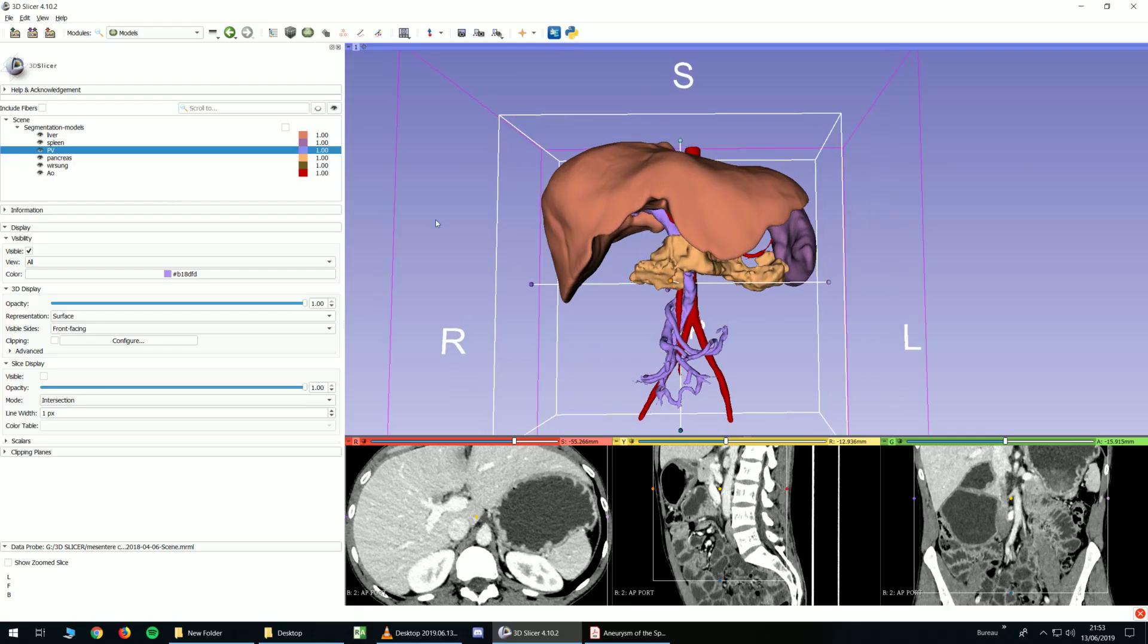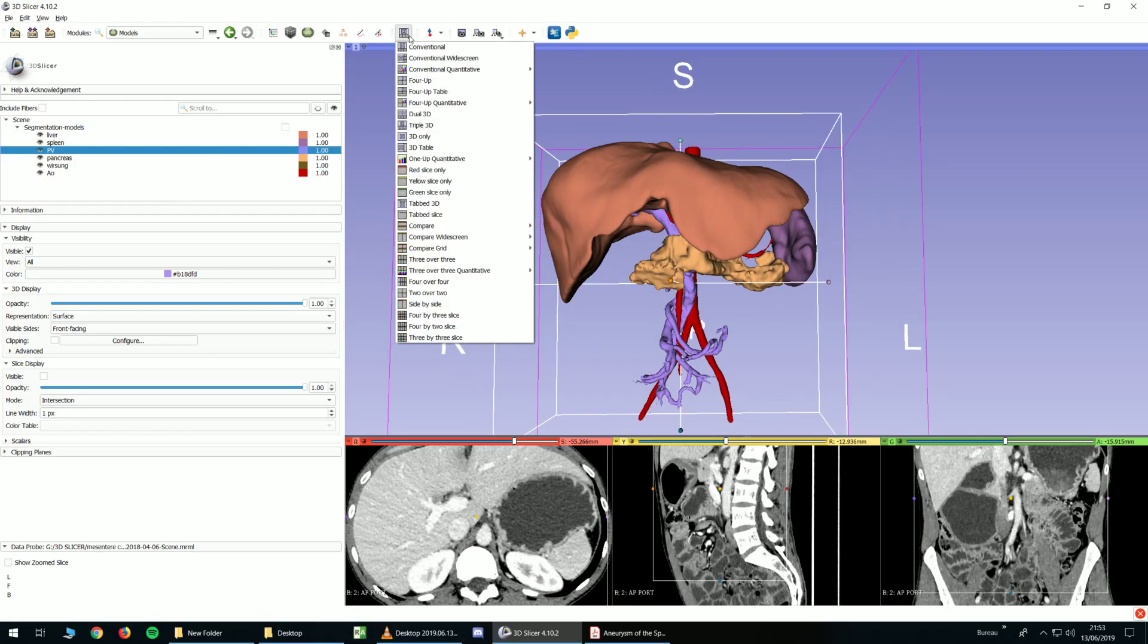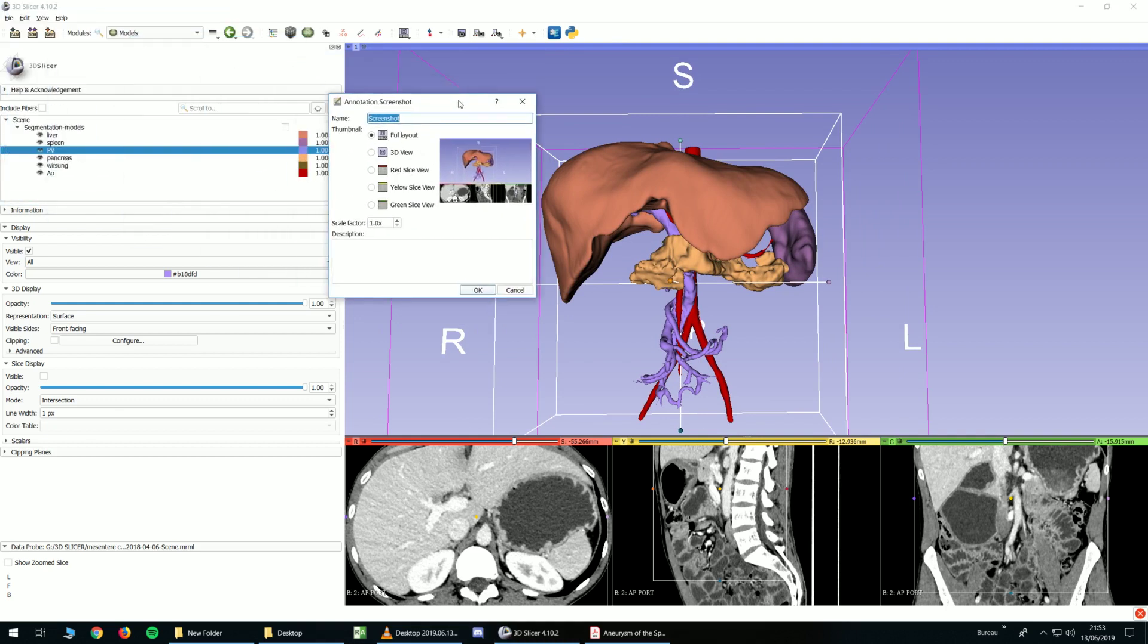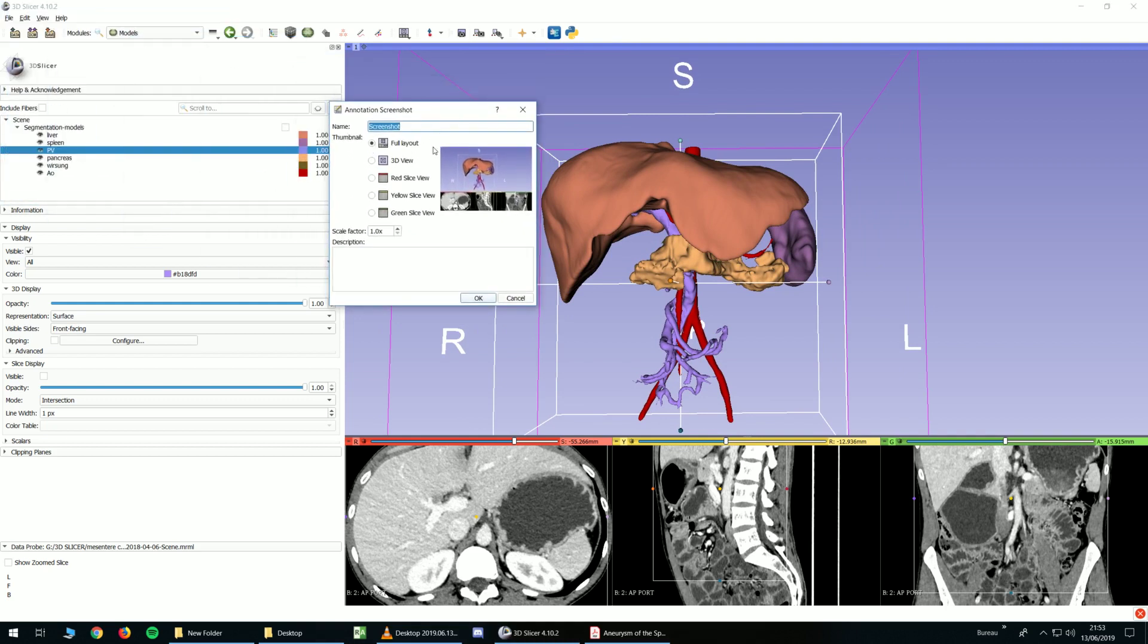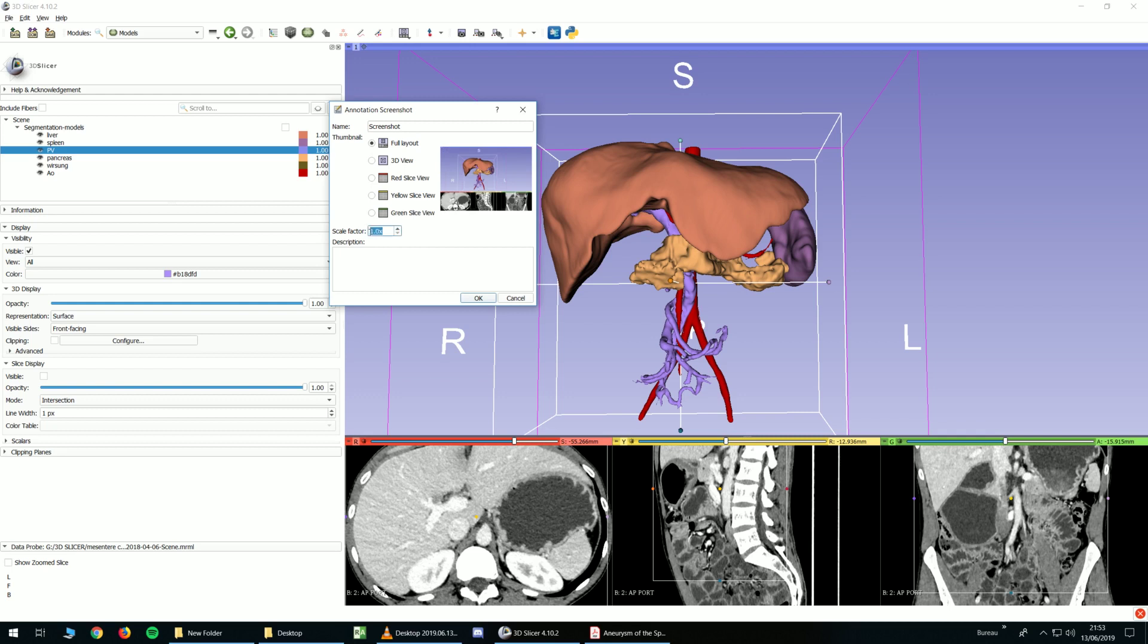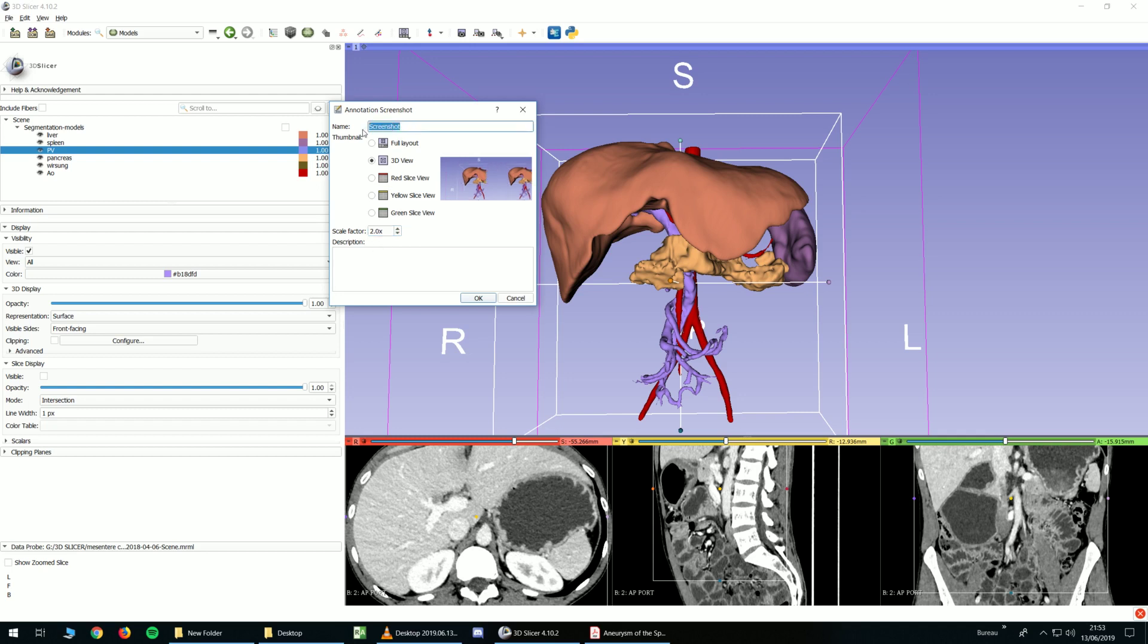For example, you can use this tool for creating an image. You can use all the layouts, only the 3D view or whatever slices you want. And you can change Scale Factor to increase or decrease the resolution. Rename it and click OK. It will create a screenshot of this. For example, I can use a 3D view. Scale Factor, I can set it to 2. I call it 3D view. And I click OK.